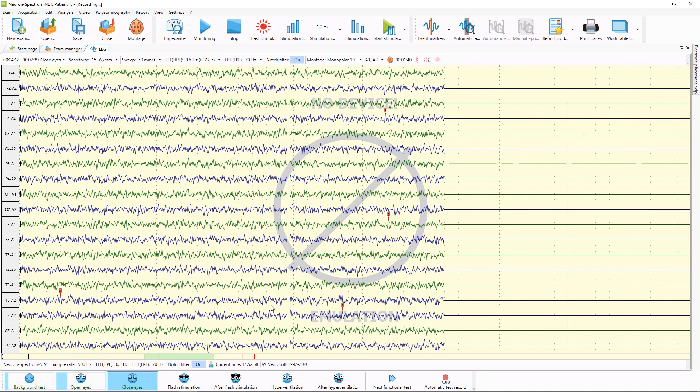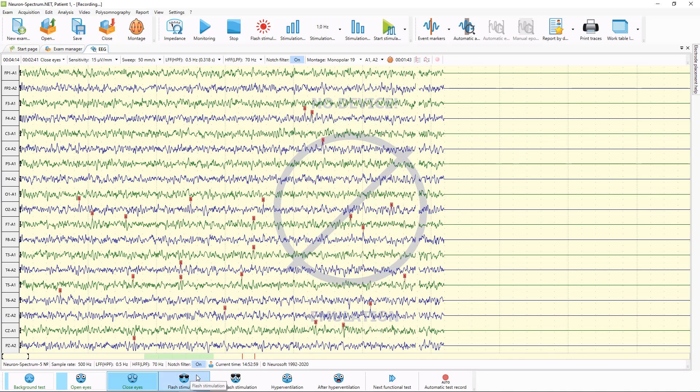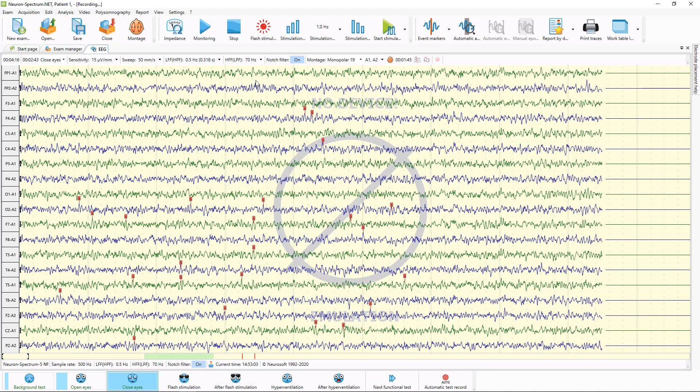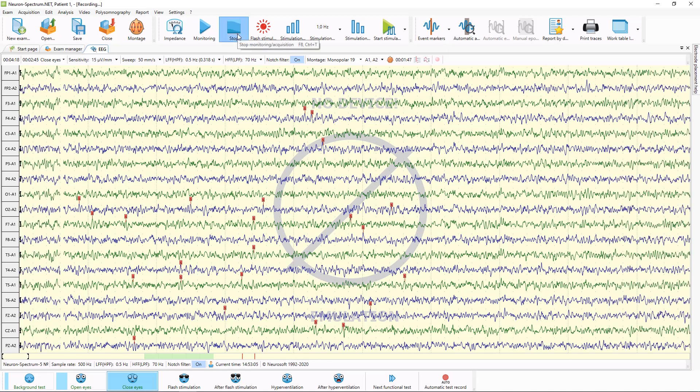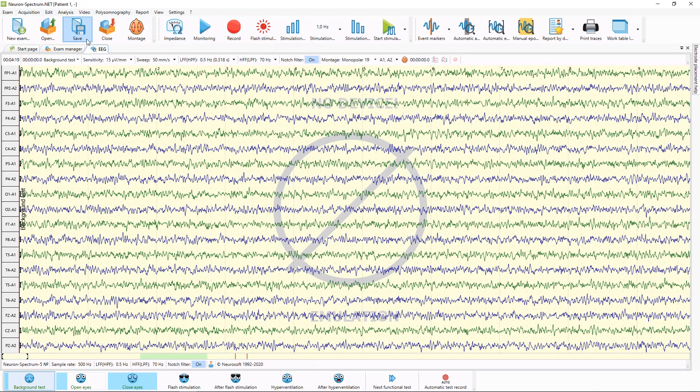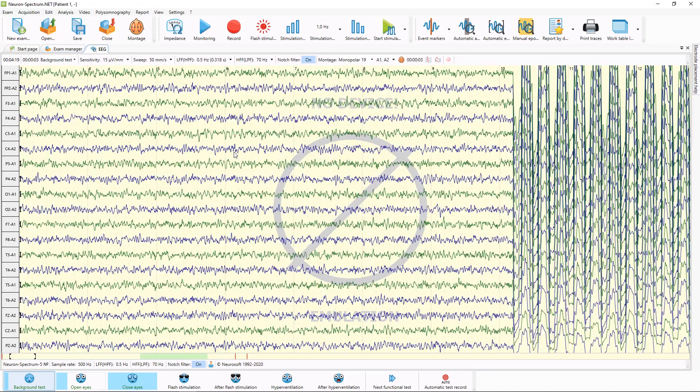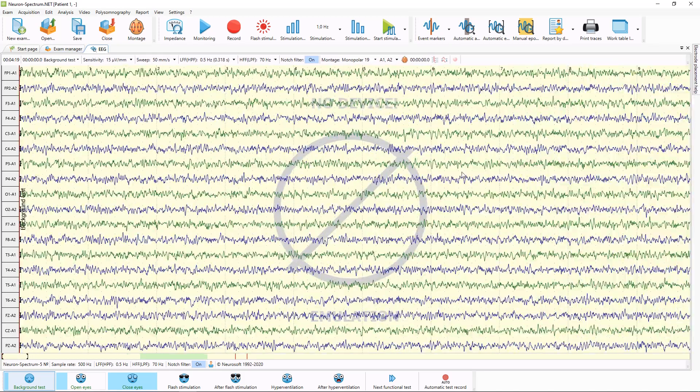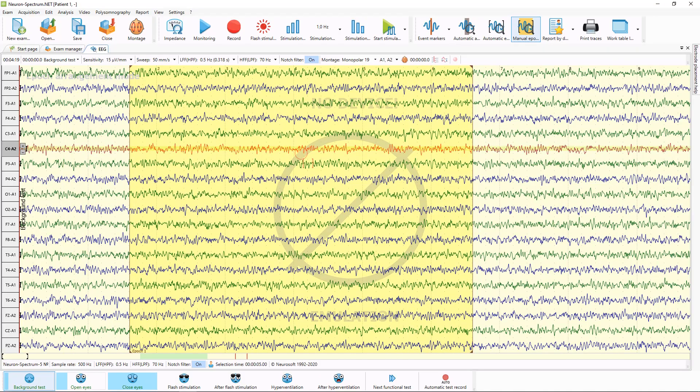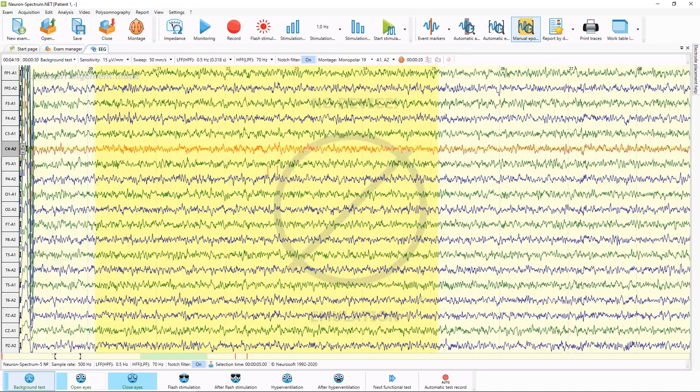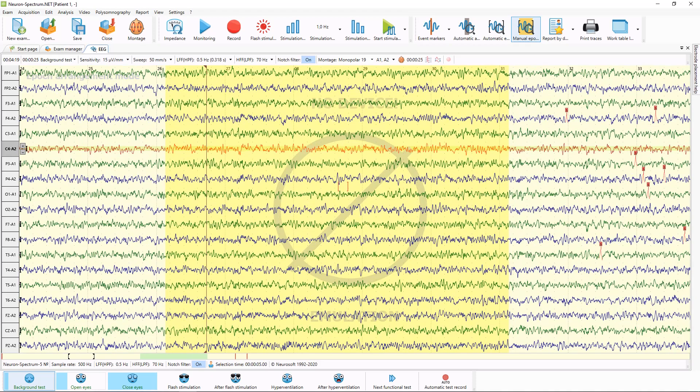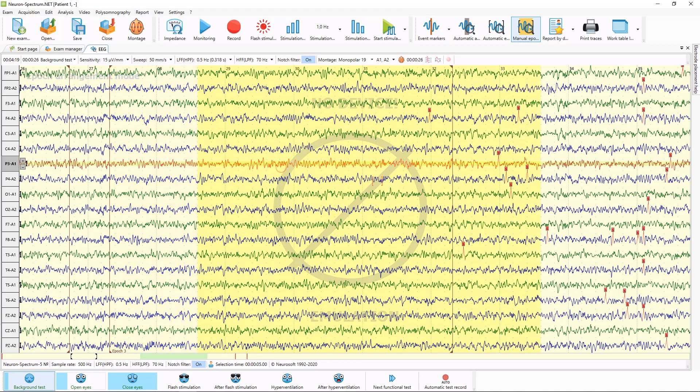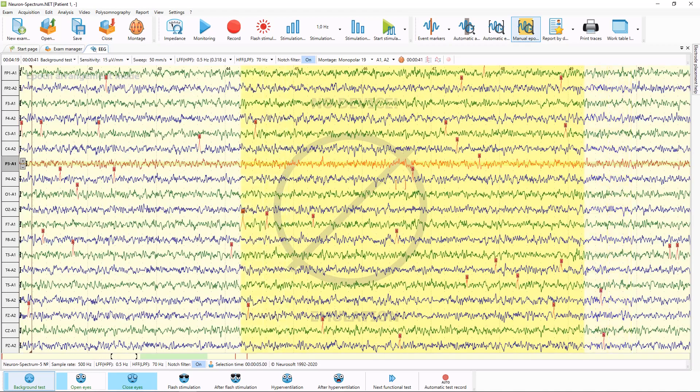So when all functional tests of your recording is finished, you can press stop button to stop acquisition and save button to save all data. Now you can start to analyze the examination with help of manual epoch placing tool like this. We can review traces with mouse and we can find some good episodes and mark them as epochs like this with mouse click.